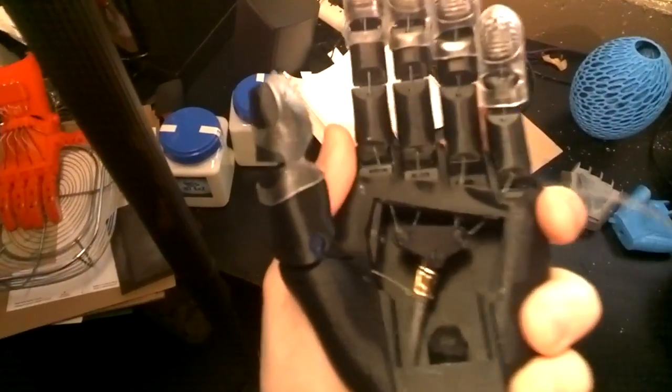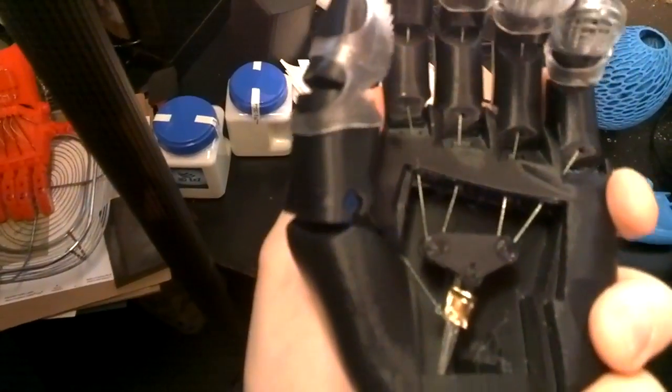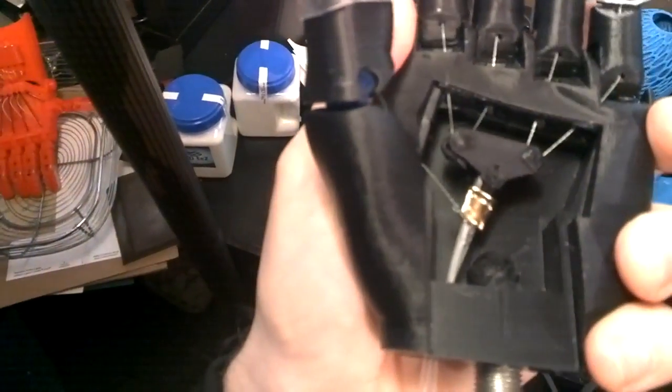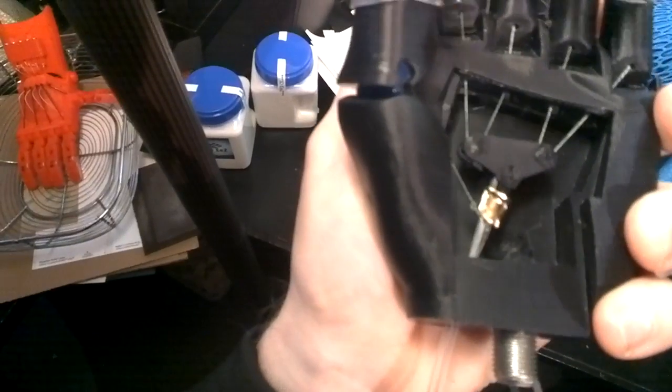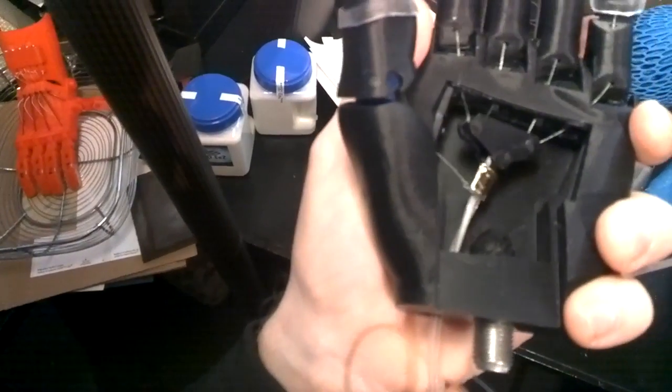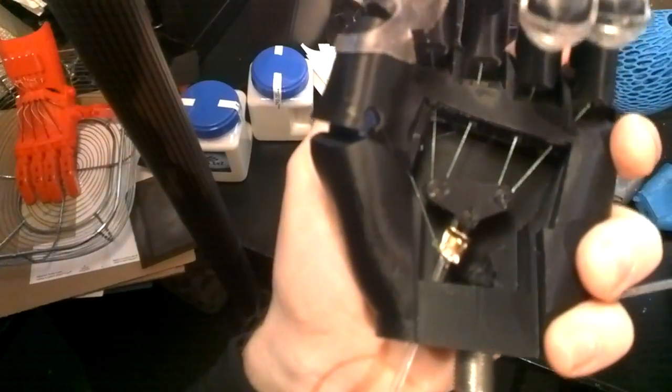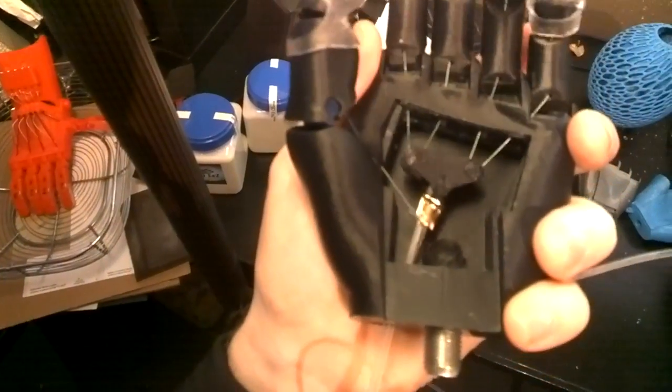And so you can see inside there how that mechanism works by pulling the one line that's operating all of those strings.